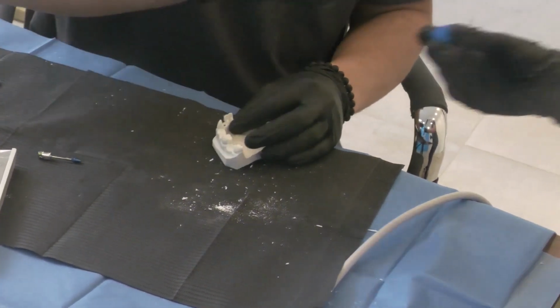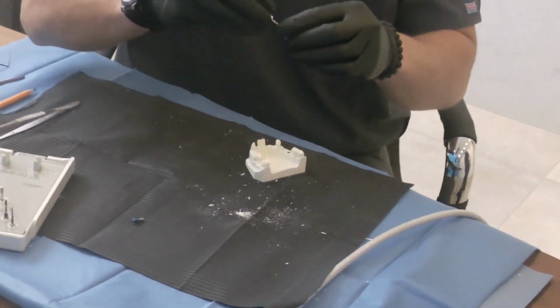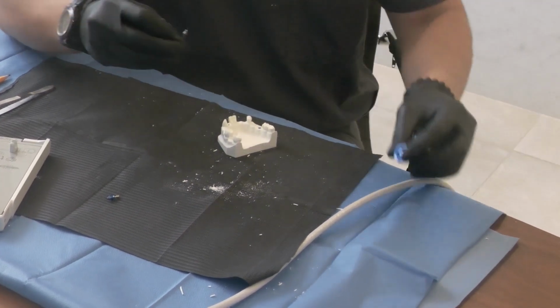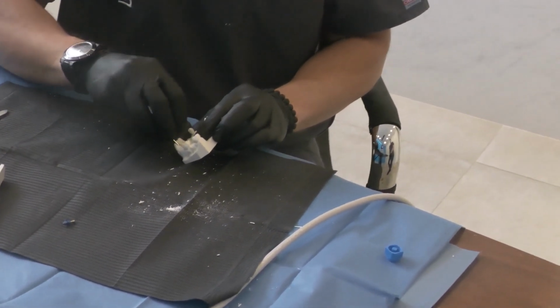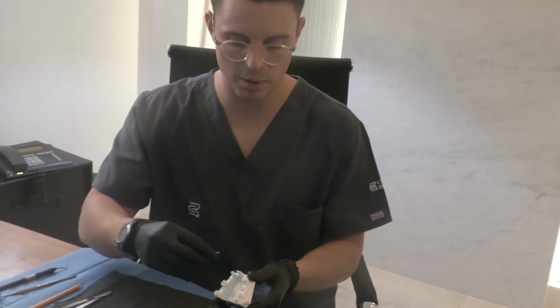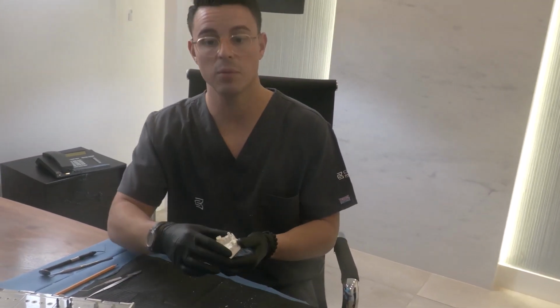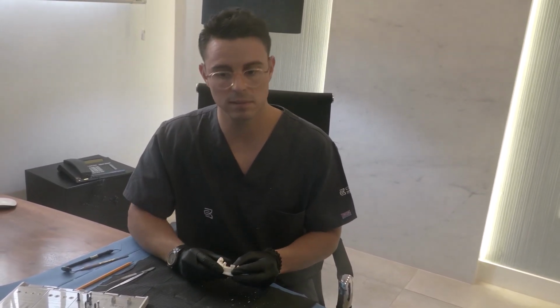So now it's time to place the cover screw and promote the submerged healing. The healing period varies, but I will suggest to go for 2 months of healing if you achieve a decent primary stability. If there is insufficient primary stability and still you have some horizontal movement when placing the cover screw, I will suggest to wait at least 3 months.